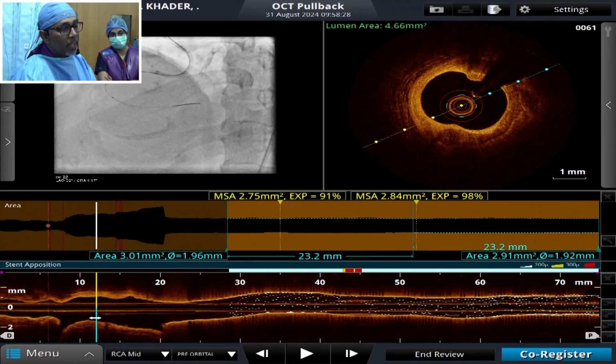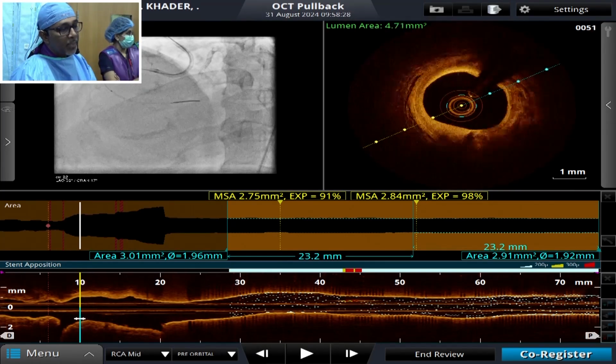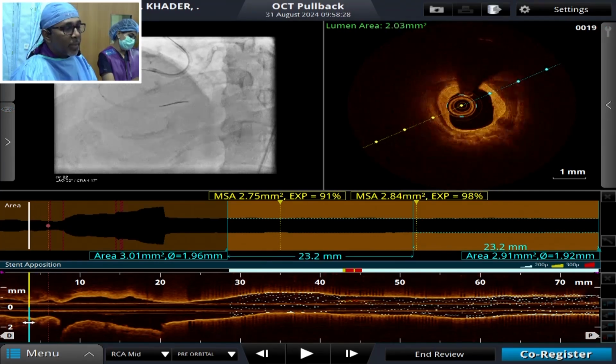As we go in, you can see this is again more of a nodular thing seen at 1 o'clock position, then intimal calcification seen down there. As we go distally inside the vessel, at these areas at 11 o'clock position, you can have the catheter being close to this particular calcium, and it's more of an eccentric calcification. In these areas you could expect sanding with the orbital atherectomy device.